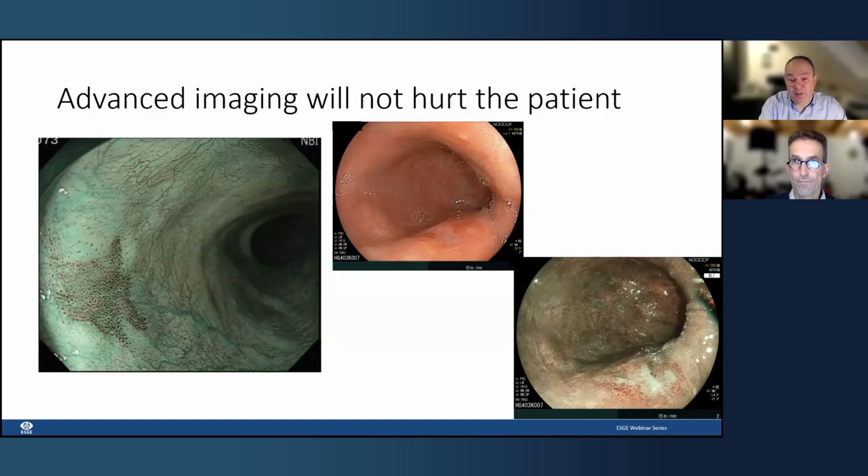Yeah, it's a good point. You should obviously pay attention not to cause injury, especially in the bulb. I think you can have some scraping of the mucosa, which can cause a little bit of bleeding or mucosal damage. It's a good point. I think you can do both as long as everything is clean and you visualize everything. I usually do it on the way back, but obviously you need to remember, if you apply too hard suction somewhere, that this is an artifact, right? Exactly. Also it has something to do with how gently you apply suction, right?